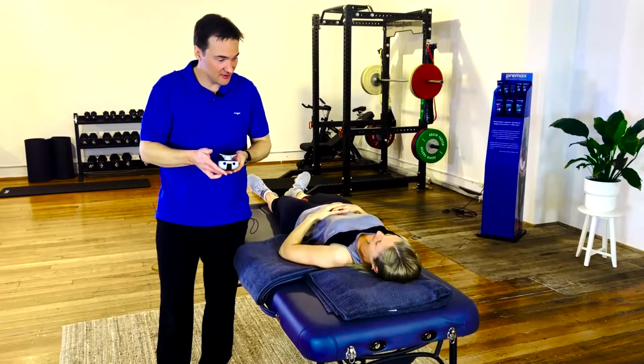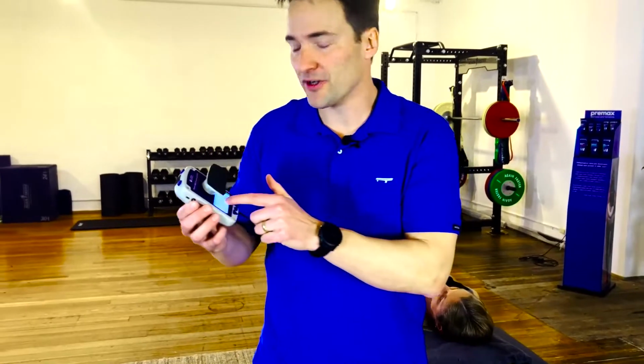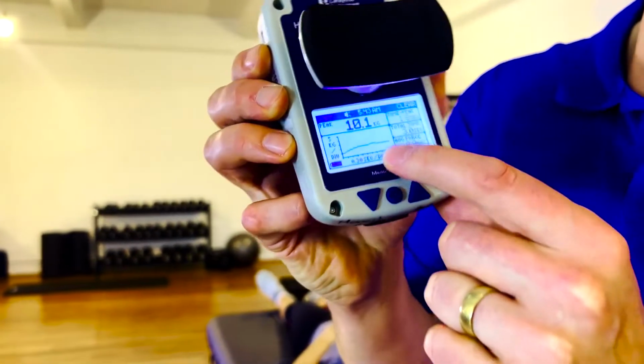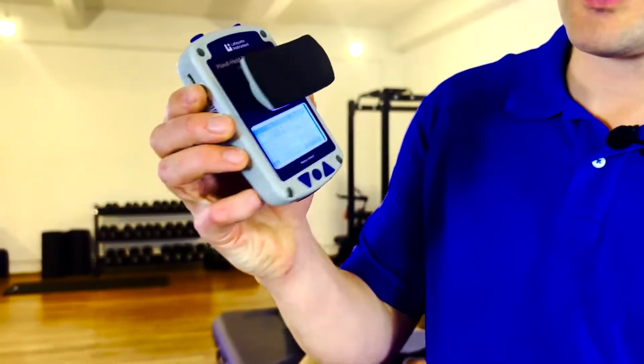10.1 kilograms. Just for your interest, some of the devices are more expensive than a $40 strain gauge you can get from Amazon, right? And some of the features you would get would be a display of force and time on here. It's not essential, but it is actually useful to have a look at where their peak force was.